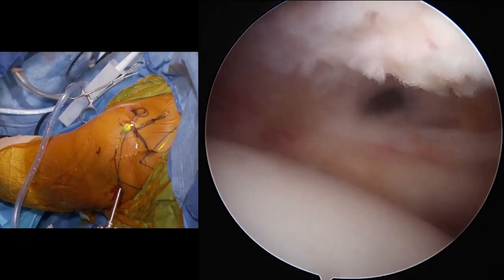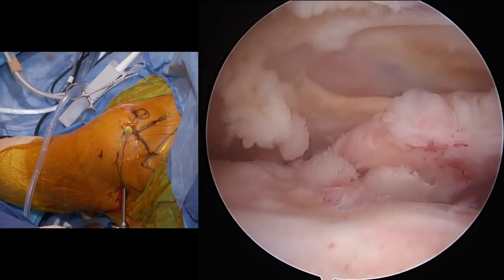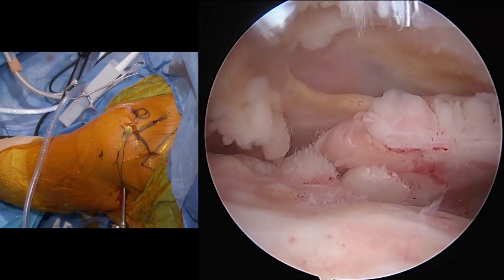All right, let's work our way to the subacromial space. So there's our tear right there. That's the front quarter of the supraspinatus. Okay, let's have the blunt for the scope.